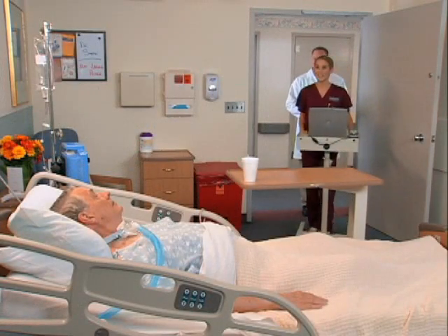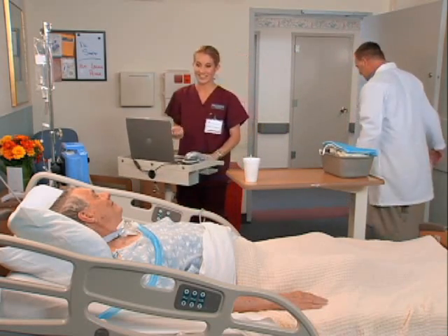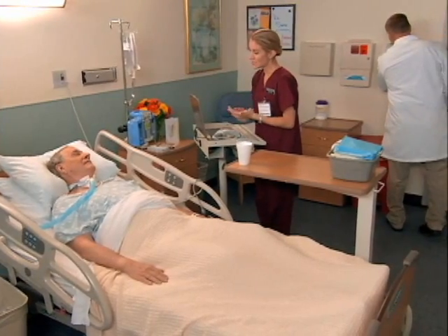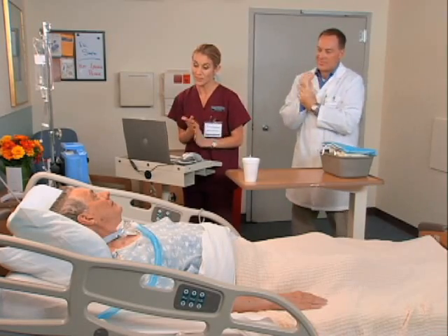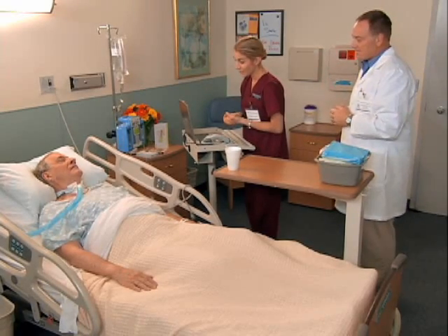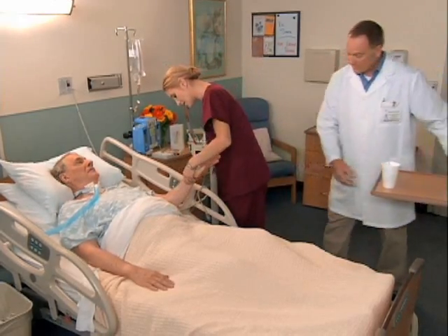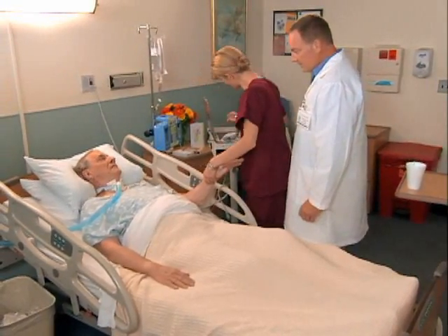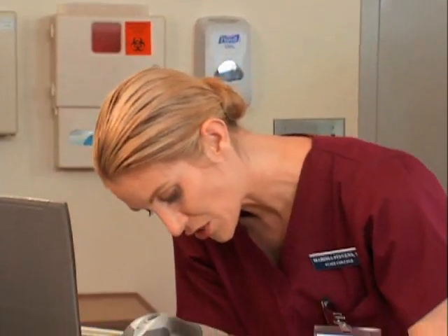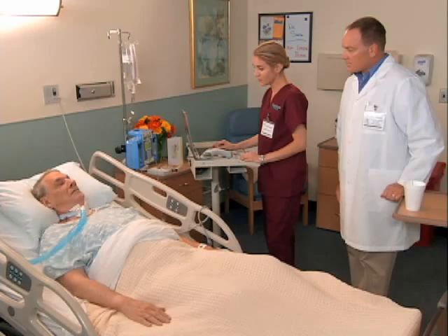Mr. Marks? Hi, it's me again, Marissa. And this is Mr. McDaniel, my nursing instructor. Hello. Since your tracheostomy is keeping you from speaking right now, you can just nod yes or no to respond to my questions. Does that sound okay? Okay, great. We're going to perform your tracheostomy care, okay? Thanks, Mr. Marks. Can I see your ID, ma'am? Thanks. Harry A. Marks? Great. And your birthday is January 21st, 1944. Great. Thank you. Now, before I get started, are you in any pain? If you were in any pain, I would address this first.